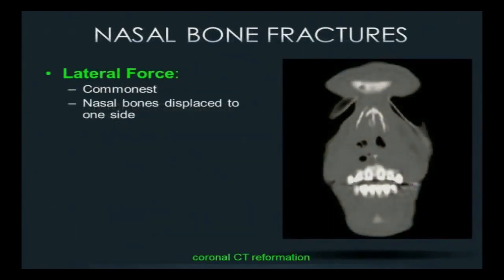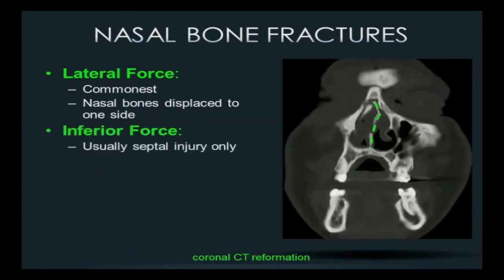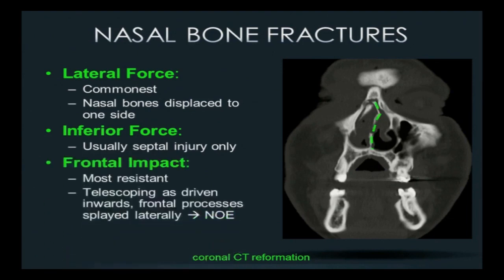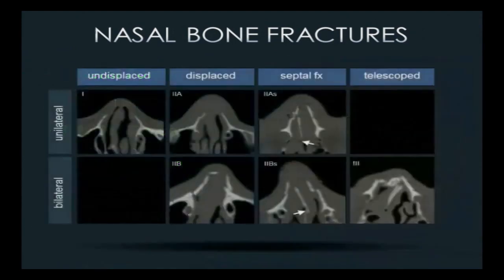The most common injuries come from a lateral force — on a coronal image you can see the nasal bones displaced to one side. An inferiorly directed force like an uppercut will more likely fracture the nasal septum. A frontal impact is toughest because of the thicker frontal process of the maxilla behind. Once you overcome that, the very fragile medial orbital wall bones telescope, driving us into the NOE territory. When describing nasal fractures, you want to note displacement, septal involvement, telescoping, and whether the injury is unilateral or bilateral.